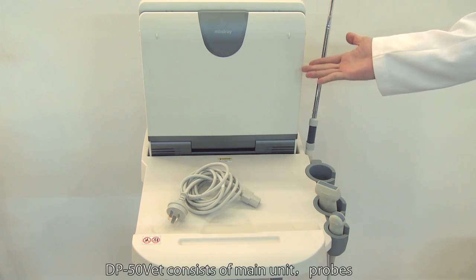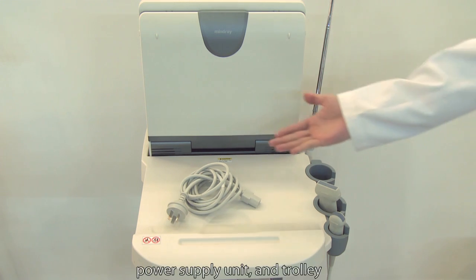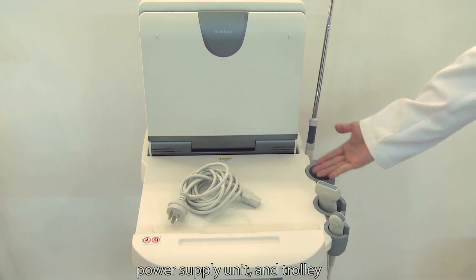The DP50VET consists of a main unit, probes, power supply unit, and trolley.